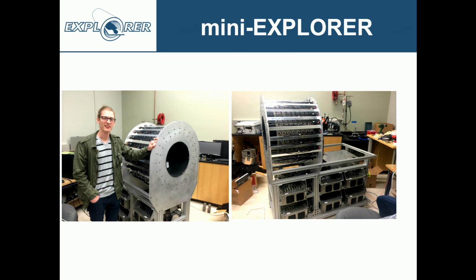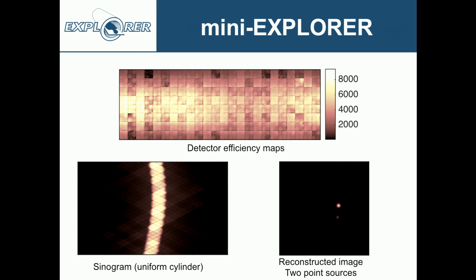So these are the design drawings, complete with graduate student, as you can see here. And here's the actual reality in the lab. We've actually constructed this system now. And this is Eric Berg, who's taking the lead as a graduate student in my lab, on testing this system. And literally just 2 days ago, this was the most recent data we got. We're getting the first data out of the scanner, not very exciting yet. It's just showing that the detectors are all working. We're collecting data. We're actually able to reconstruct images of point sources. So we're well on the way to getting this functional, and this will be a great testing ground while we build the human version, the much bigger version.